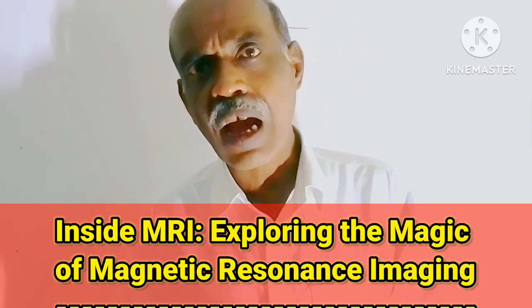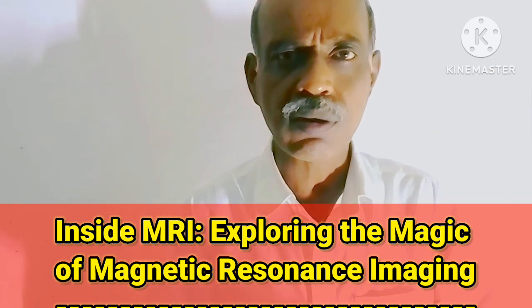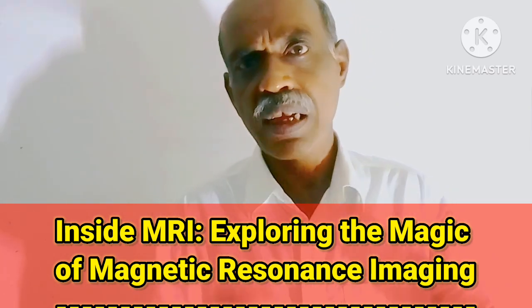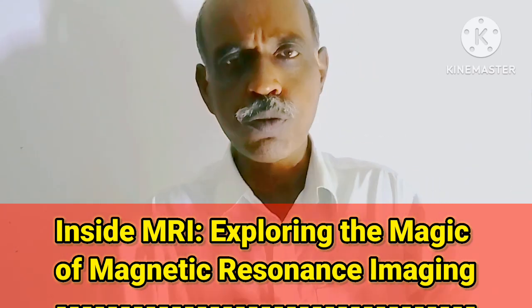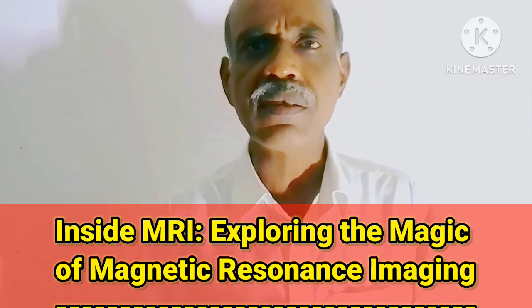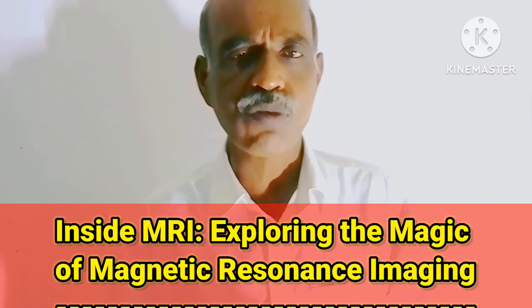Signals are received by the coils of the MRI, and processed mathematically using computers, not manually. If you integrate this with AI, artificial intelligence technology, then it will be superb. Today in many clinical centers, MRI integrated with AI equipment is also used.